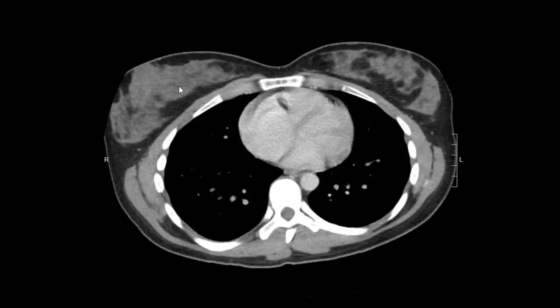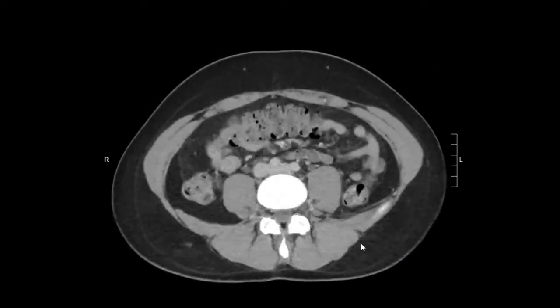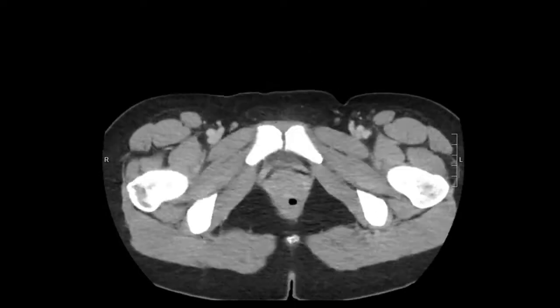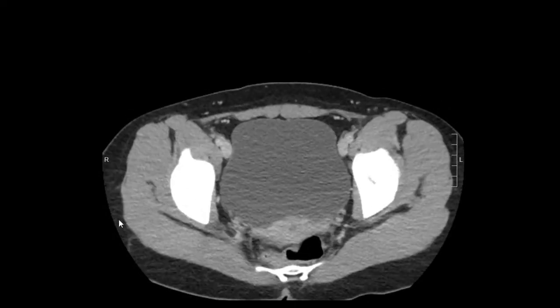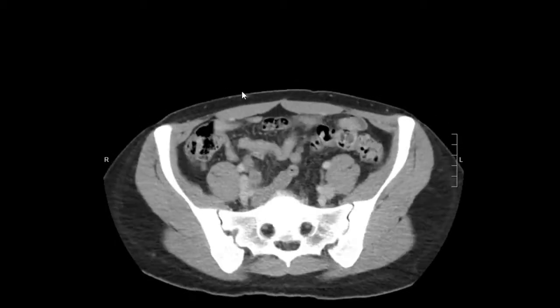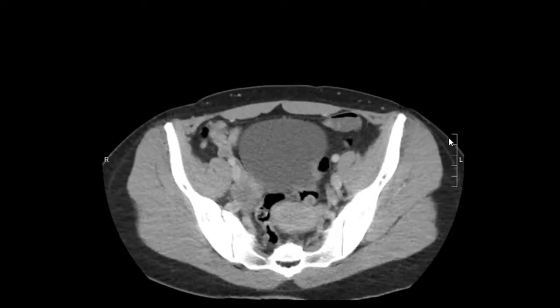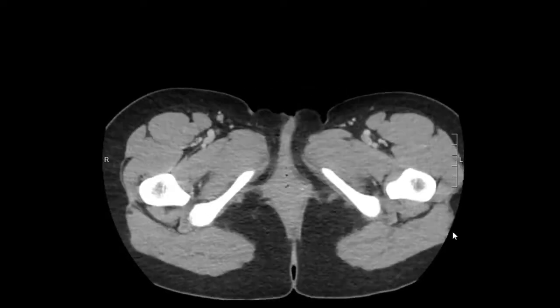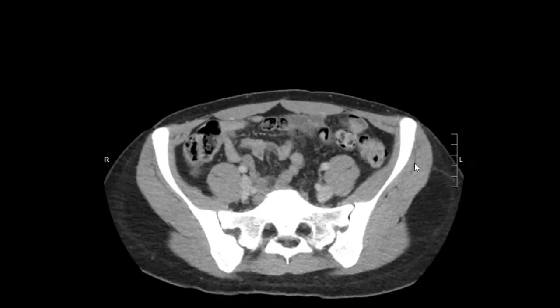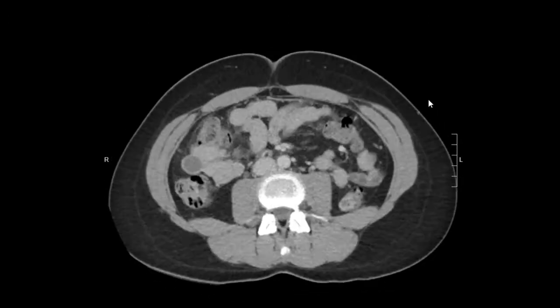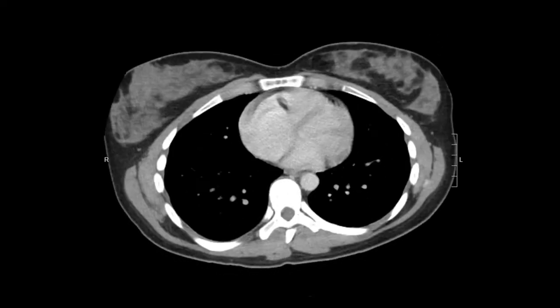We're going to look at the anterior wall. The superficial subcutaneous tissues look normal. Evaluating the musculature and the subcutaneous tissues on the right — that looks normal. We'll go towards the left, and the muscles and superficial subcutaneous tissues look normal. And then posteriorly — everything looks pretty normal.